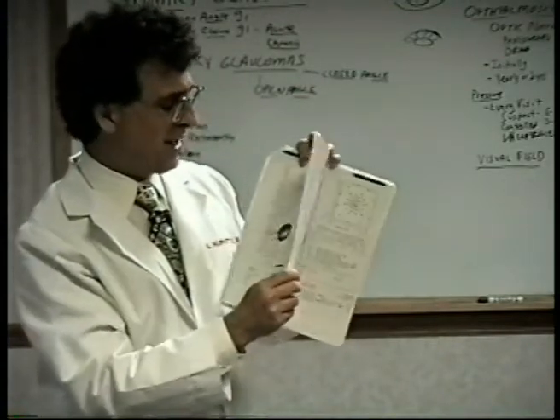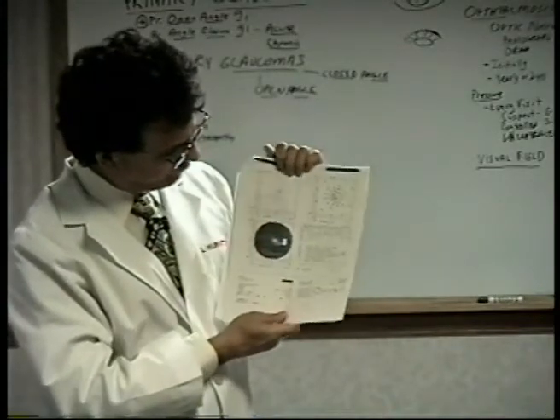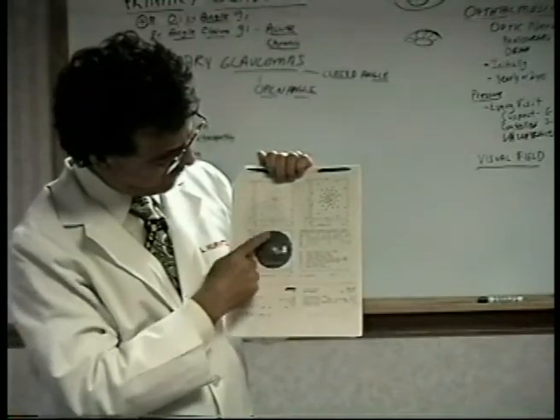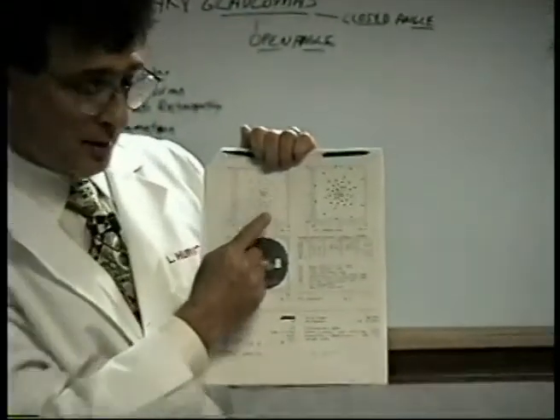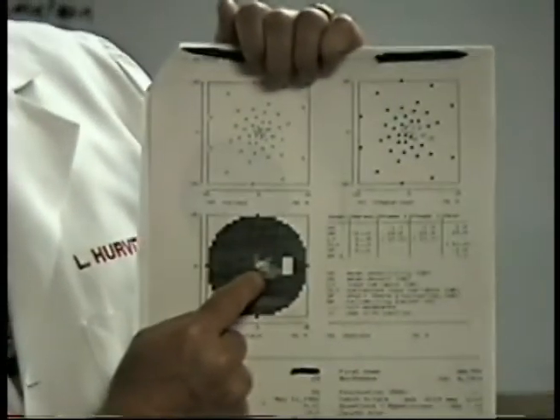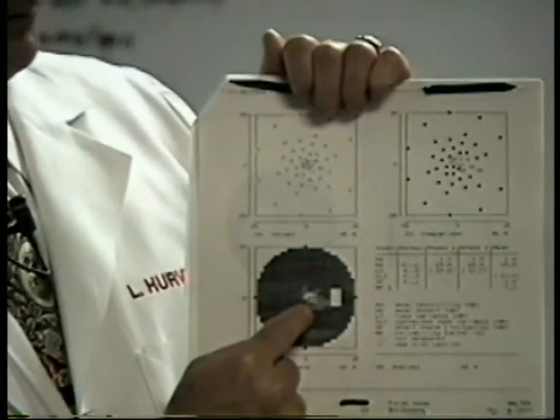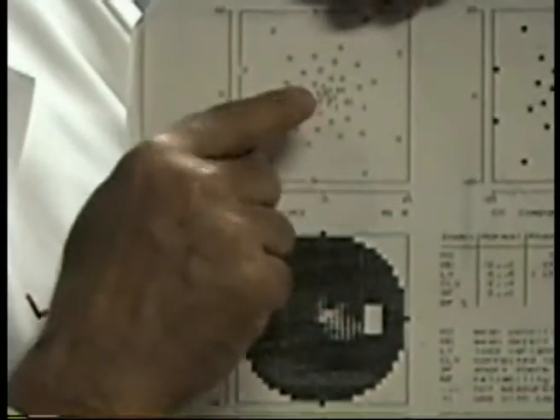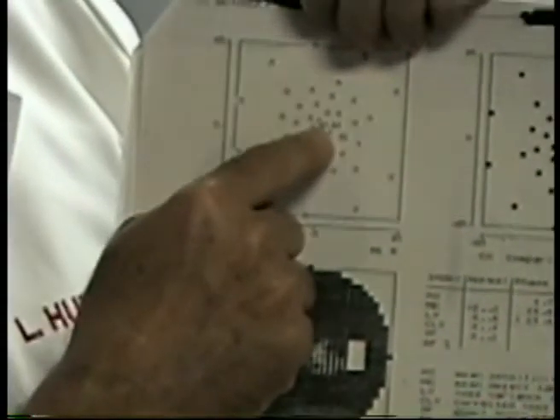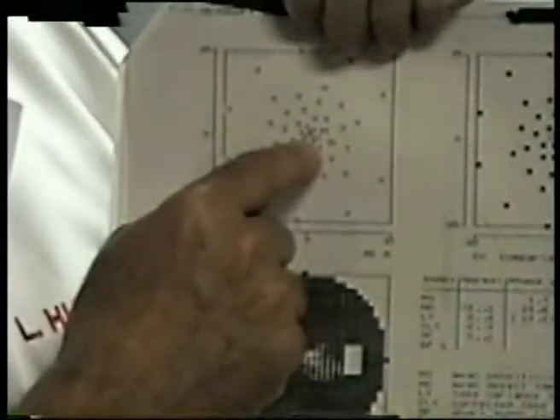This is another person that has an even smaller bit of vision. This zooms in on the central 25 degrees, but it concentrates a lot of the tested points right near the center. And you can see very few of them are still there. This person probably doesn't think they see real well, but they might still see 20/20, because your 20/20 is all in the very dead center.